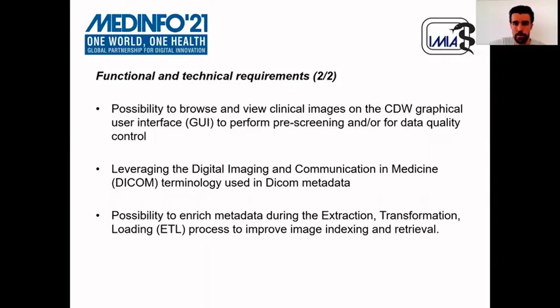And we will have to leverage the DICOM terminology used in the DICOM metadata. And we want to be able to enrich the metadata during the extraction, transformation, and loading process to improve image indexing and retrieval in our data warehouse.